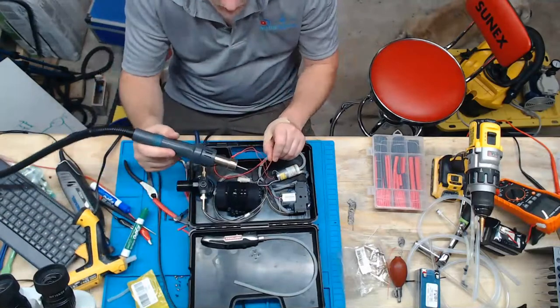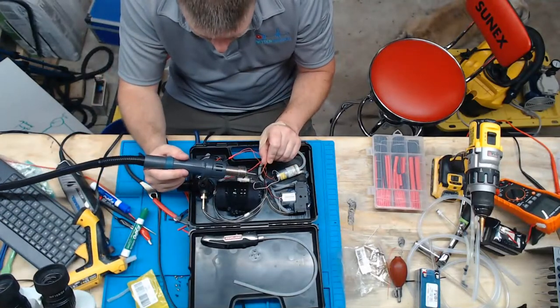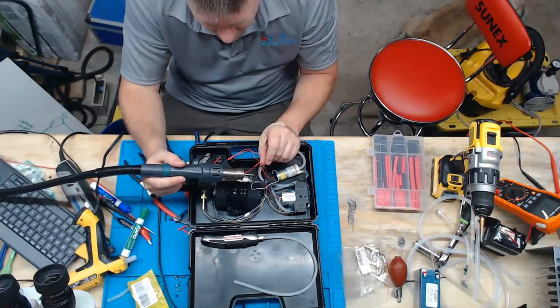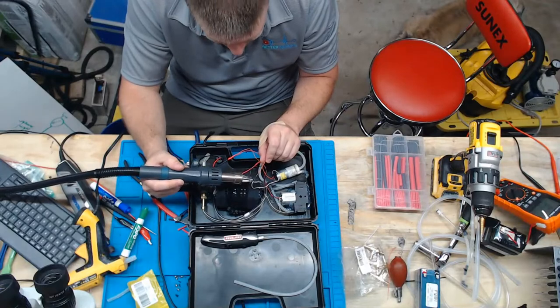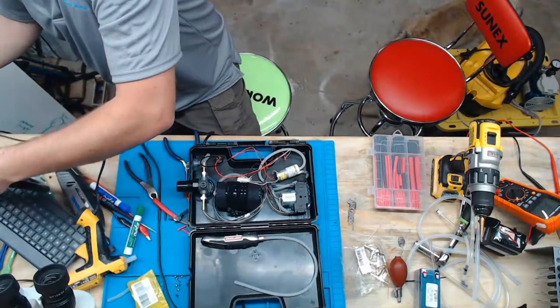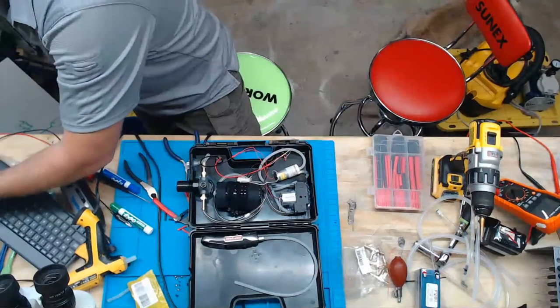All of these are dual layer shrink tube. So I'll heat them up probably more than what you'd normally see somebody heat up shrink tube. Makes that little glue squirt out the sides. Makes a very tight, watertight connection. All right, there we go.